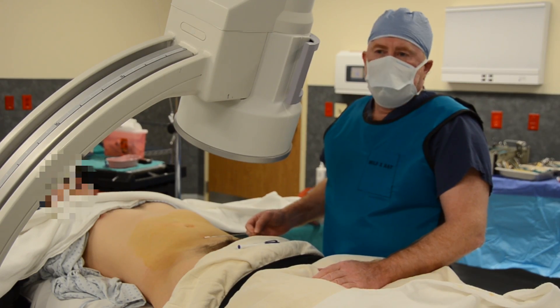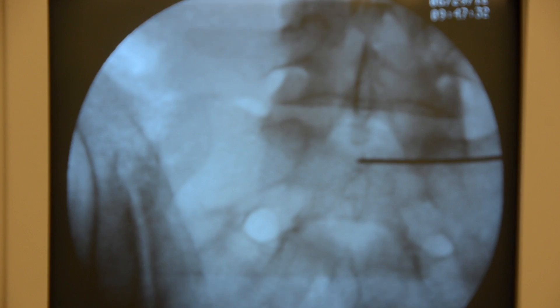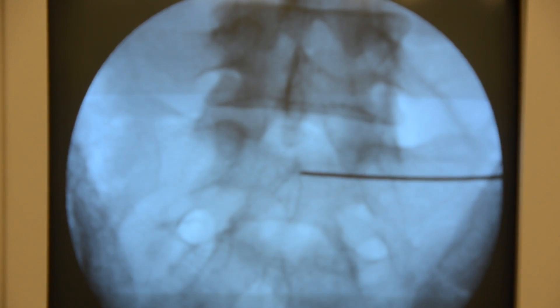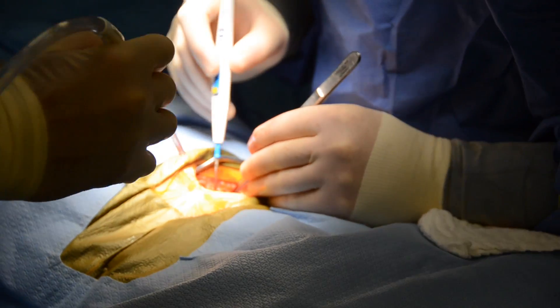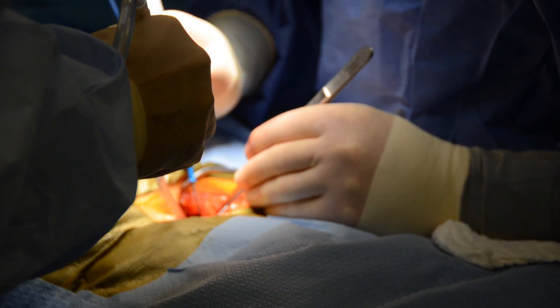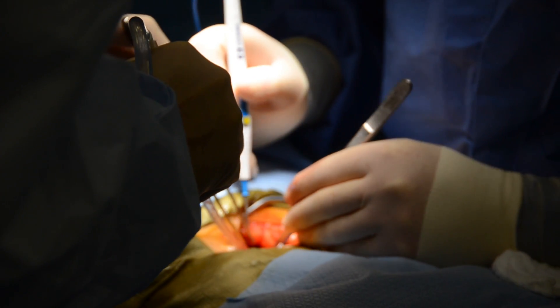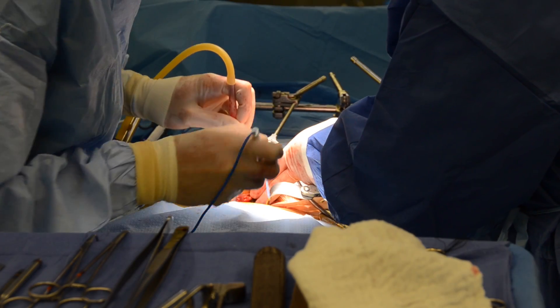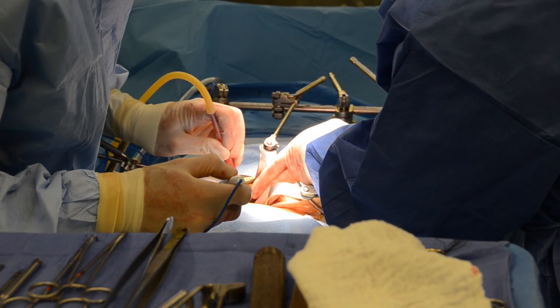Fluoroscopy is used to help with the initial incision for approach. Here we are showing the midline at L5S1 to help with the initial incision. A skin incision is made and a retroperitoneal approach is taken to the L5S1 disc space. Special retractors are placed to give safe exposure of the L5S1 disc space.